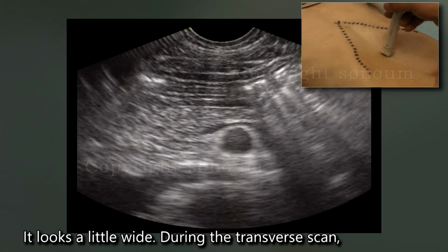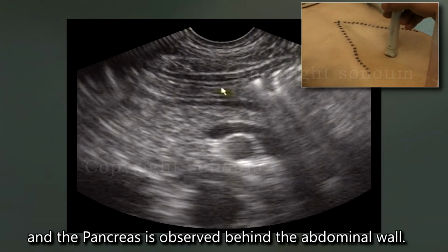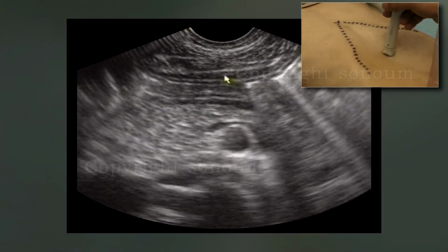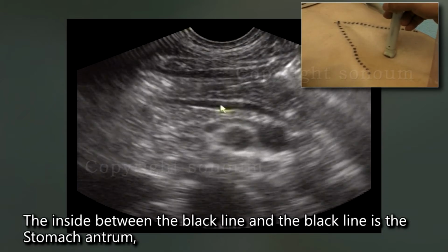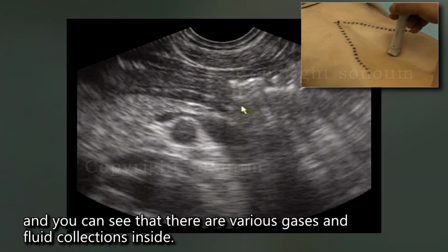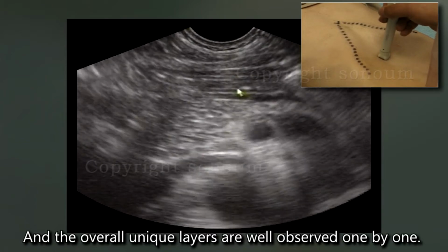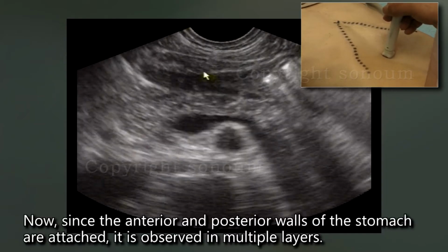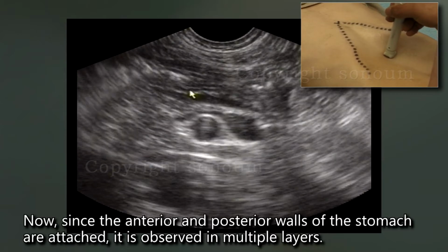During the transverse scan, the stomach antrum is visible just below the abdominal wall, and the pancreas is observed behind it. The inside between the black line and the black line is the stomach antrum, and you can see that there are various gases and fluid collections inside. Are you not seeing a lot of gas shadows? And the overall unique layers are well observed one by one. Now, since the anterior and posterior walls of the stomach are attached, it is observed in multiple layers.